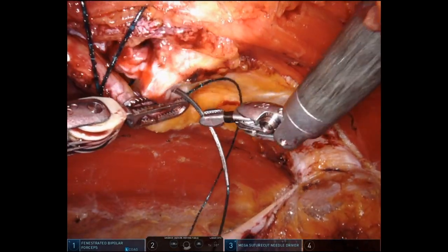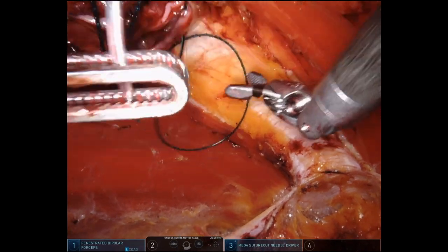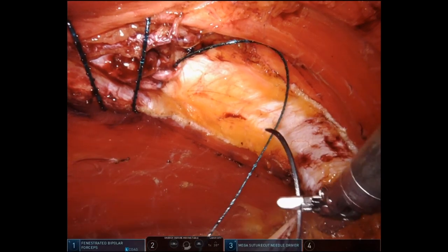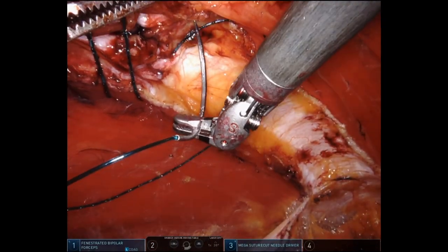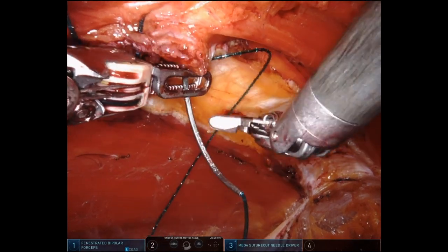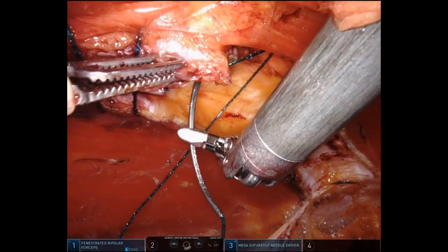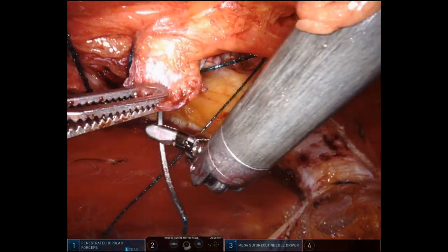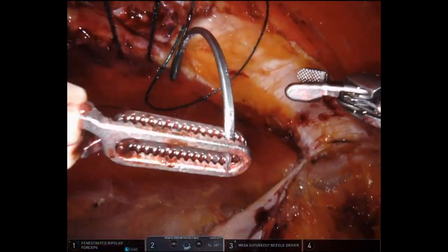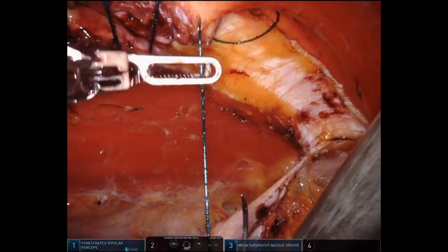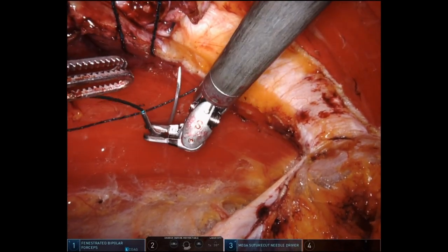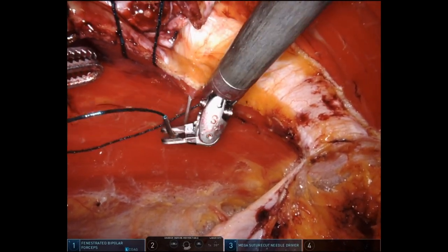As you can see, as I get to the epigastric area, I'm docked on the left side. My right hand — the needle driver — is suturing at a very awkward angle. I can't get perpendicular to the Linea Alba, so the suturing becomes quite challenging. As I proceed, I'm not going to be able to get the types of bites I want on the Linea Alba.